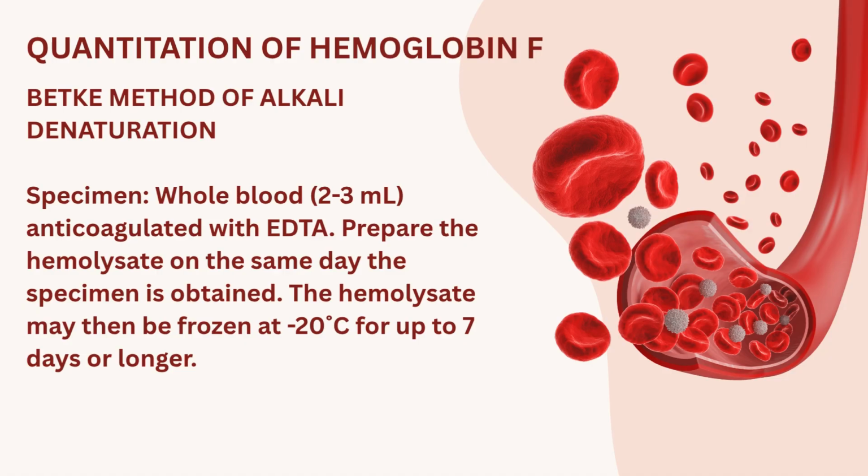So the specimen for this method is whole blood anticoagulated with EDTA. So you should prepare the hemolysate on the same day the specimen is obtained. So the hemolysate may then be frozen at negative 20 degrees Celsius for up to 7 days or longer.